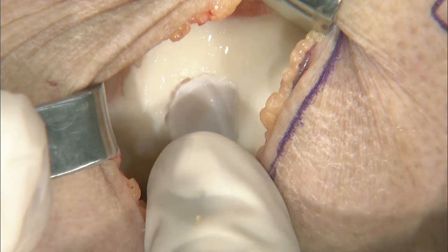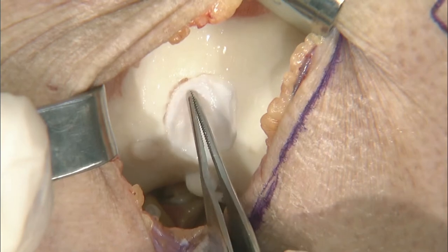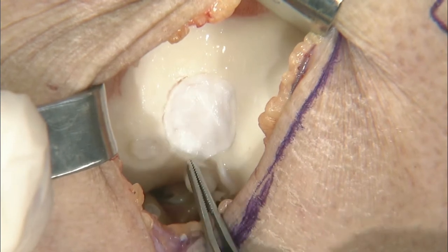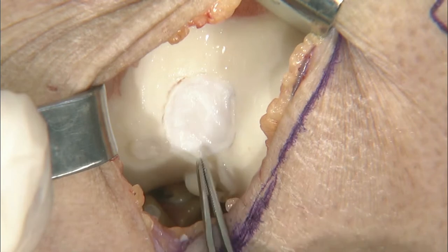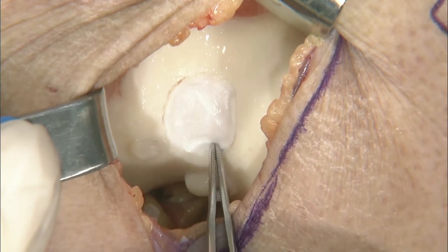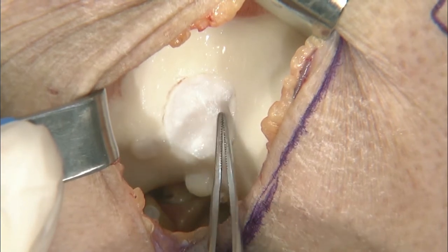I won't hold it in there because I'm concerned about that type of thing where you see that basically I've created some ridges right there and it's actually shifted. So I like using really just the pickups to kind of go around and very gently just make sure that it's underneath all those surfaces. And what you don't want, and where it's pretty important to make sure, is that you don't want this up along the edges of it. If it's up along the edges of it, it's going to create a problem going forward.